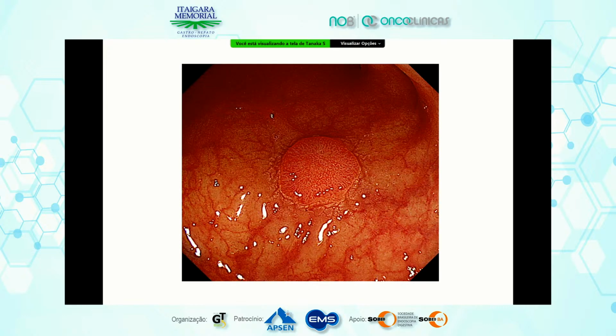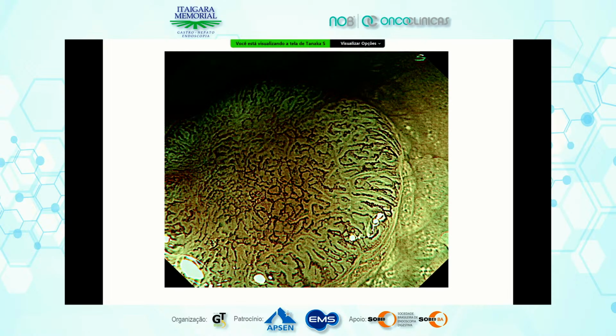What do you think of this lesion? Tiny, less than 1 centimeter in diameter, flat lesion. This is NBI magnifying view. This view is not best because observation is oblique.